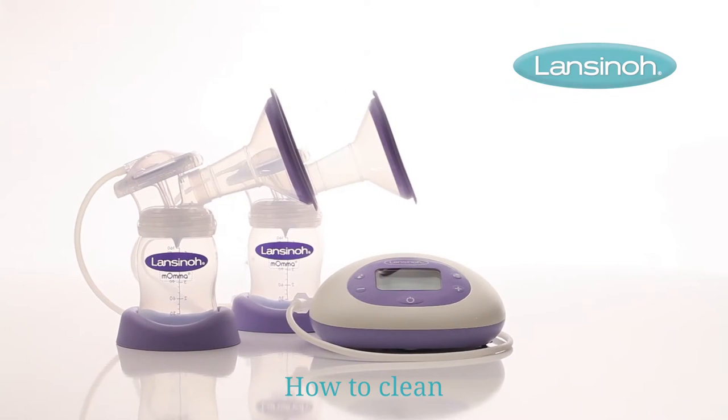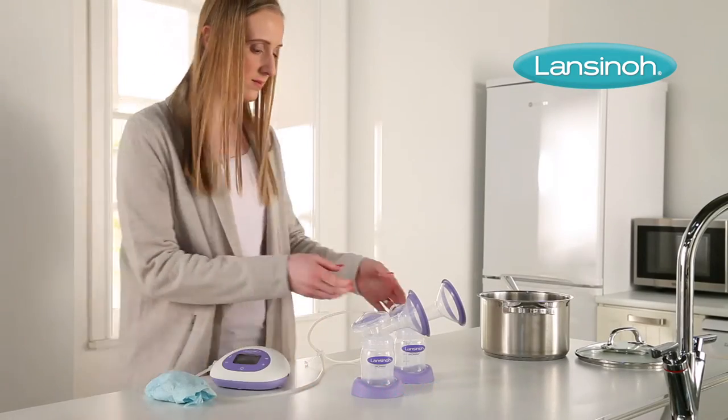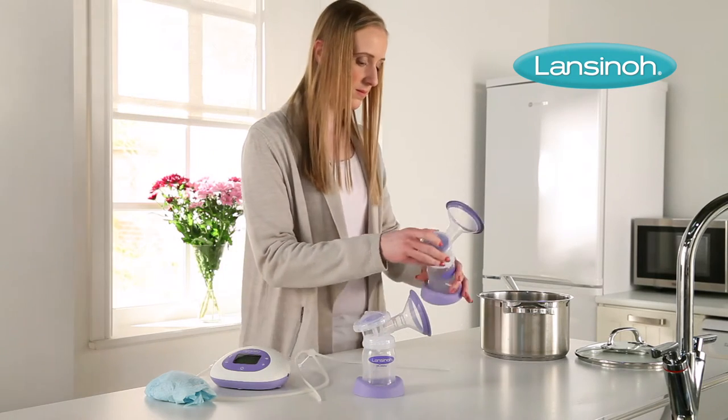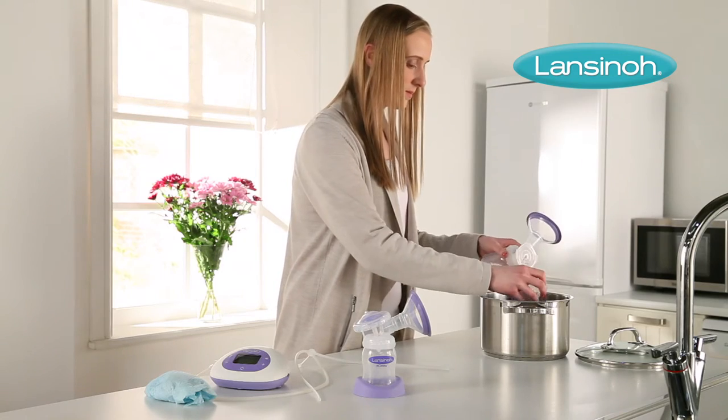Lancino Smart Pump and Signature Pro Double Electric Breast Pumps are simple to clean. When you're cleaning the pump, set aside the tubing and tubing connector. These don't need to be washed or sterilized because the diaphragm prevents them from coming into contact with breast milk.